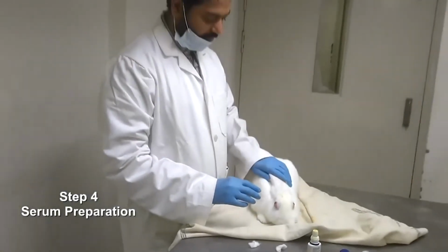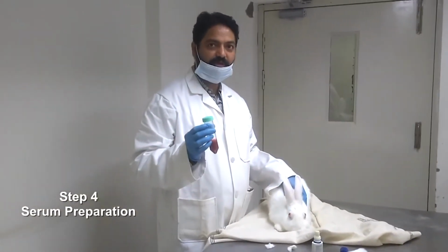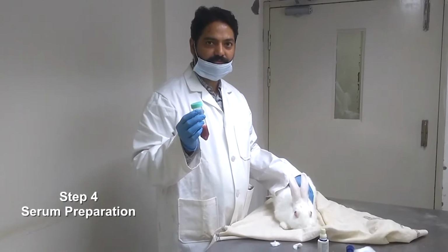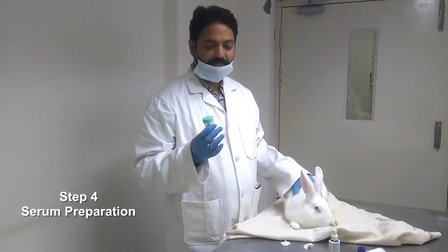So we have isolated approximately 10 to 12 ml of blood. This will give us approximately half of that volume as serum.